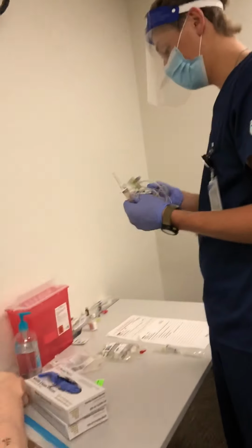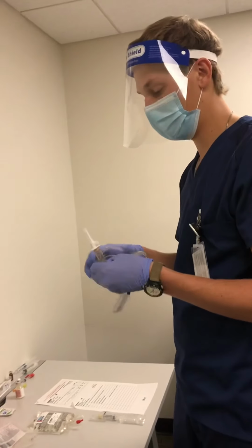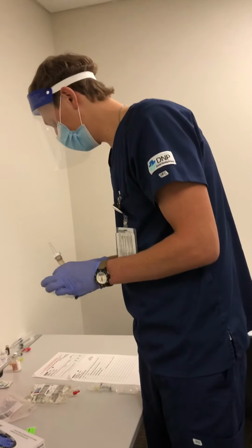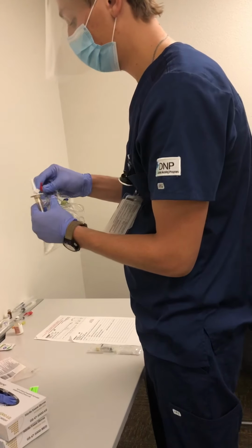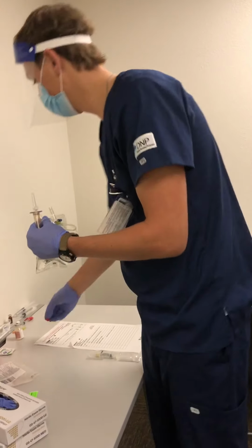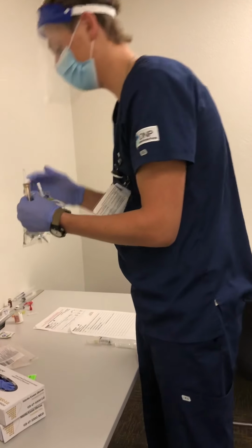Make sure that it is locked. Okay. And now I can pull my port here. Pull my spike port cover.